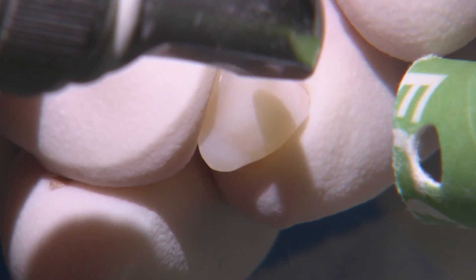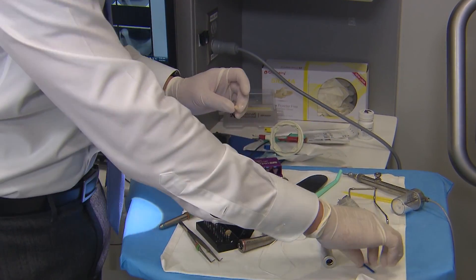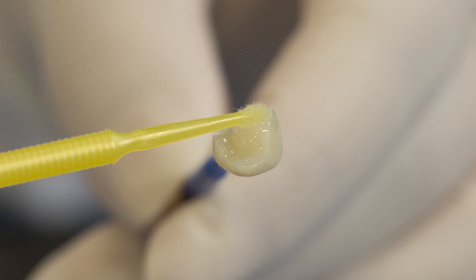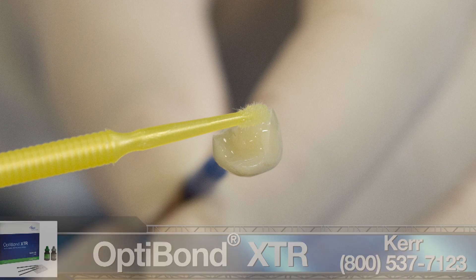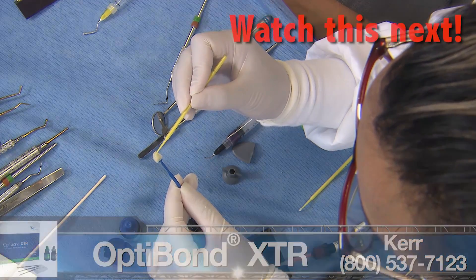For the restoration, the internal surface of these resin-based materials needs to be etched using 50 micron aluminum oxide. Once etched, rinsed, and cleaned, we apply Kerr's OptiBond XTR adhesive to the internal surface. To keep film thickness to a minimum, we aspirate the excess, air thin, and then light cure for 10 seconds.